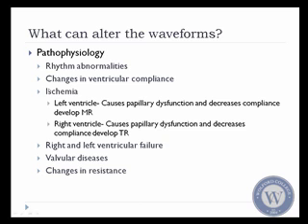You can also see changes in ventricular compliance, which can alter the actual waveforms. Instead of being more of a linear relationship, if you have a decreased compliance, it can become much more responsive to volume changes by increasing pressure rapidly. We'll talk about this again when we talk about ventricular compliance, so please review that.